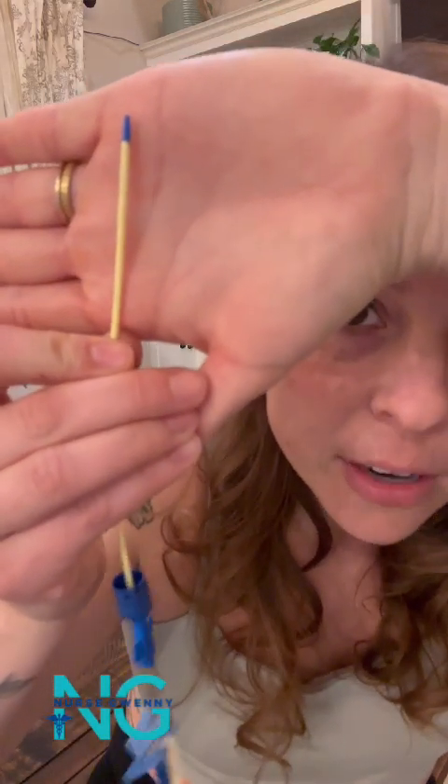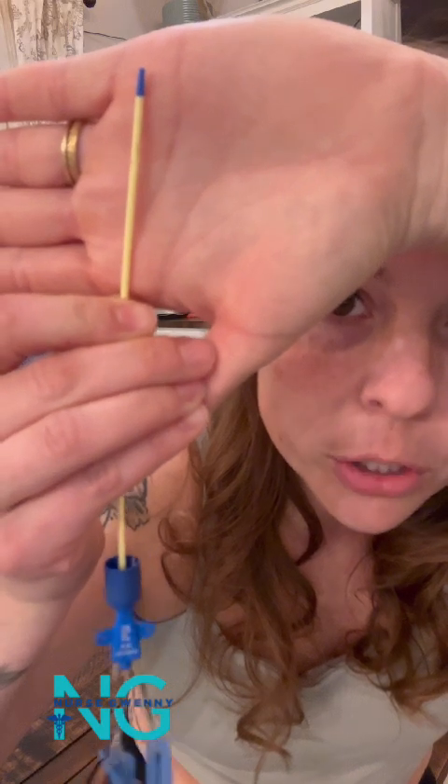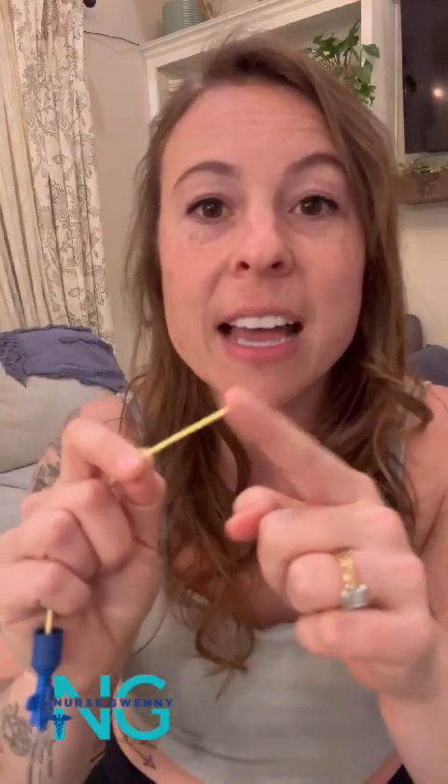It doesn't all mix together and come out the same lumen. As I rotate it, you can see right there — that's the medial lumen, there is the proximal lumen, and the distal lumen is here on the end. It's very soft on that tip, and that's because of the insertion procedure.